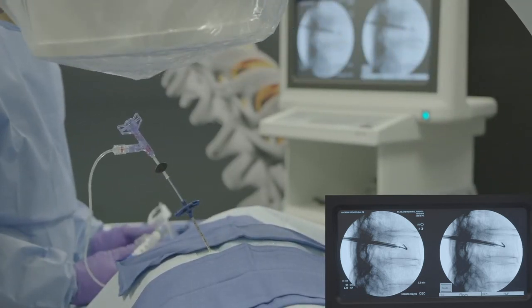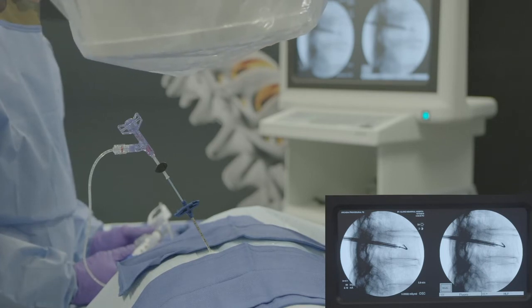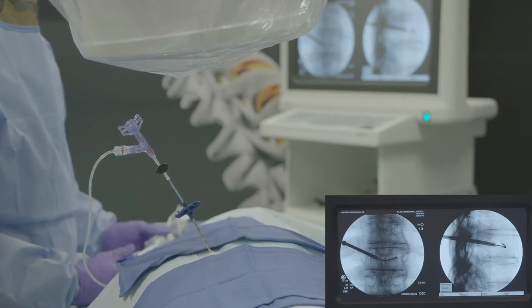Continue advancing the balloon catheter and turning the steering handle simultaneously to follow the access channel. The steering mechanism features a detectable hard stop when the maximum articulation has been reached.